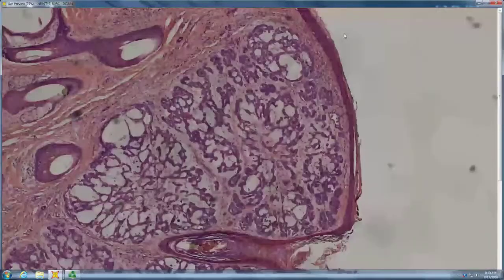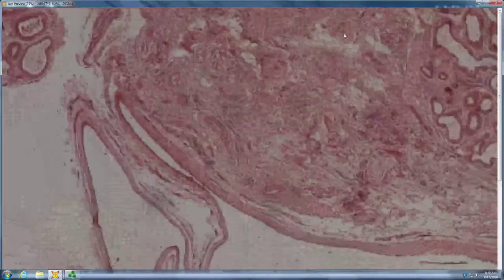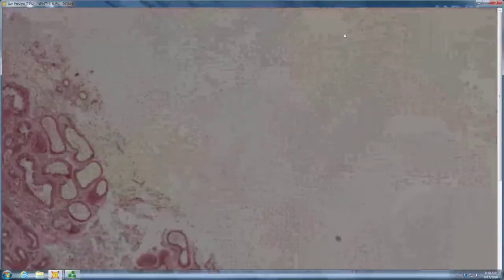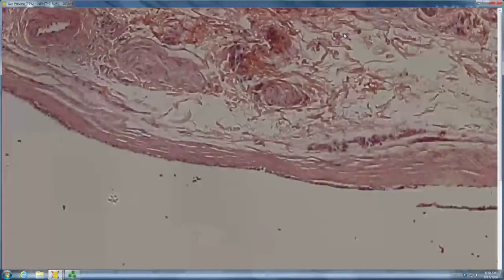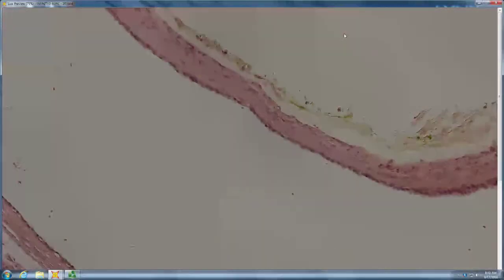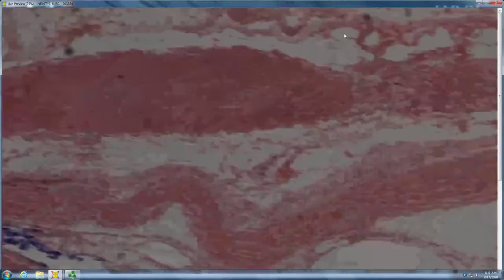Basal cell, or yeah, it's kind of mucinous. Yeah, adenoid. Adenoid BCC. Cystadenoma, does it look like a complex wall? Not really. So maybe it's just a simple eyelid cyst that gets called a hydrocystoma. I was going to say HPAP, but it's not HPAP.